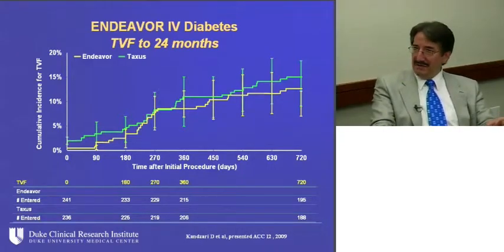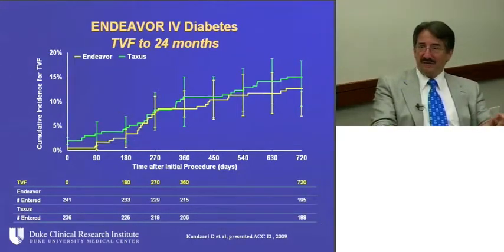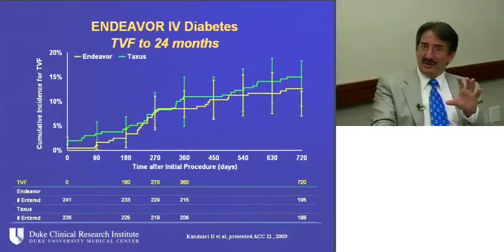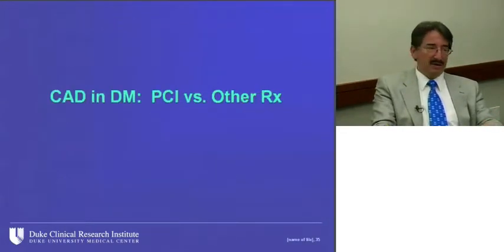Zotarolimus, a little less data available, but at least so far, compared to paclitaxel, looks similar. And again, I think we're just going to have to follow. Of course, we have a new generation of zotarolimus-eluting stent coming out with the Resolute platform. Same dose, same stent, but by changing the polymer, the kinetics, the duration of drug delivered clearly has affected late loss. Recently reported about double the late thrombosis rate at 1 year. So is this a problem? Is this just a wrinkle in the play of chance? Again, I think we have to understand a lot more than we do today to know whether zotarolimus, and over what time frame of delivery, are diabetic arteries really influenced.